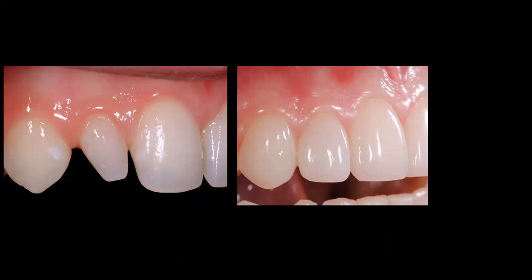So if you had an overhang, a crown margin, if you packed cord, if you cut the tooth, it's not going to look like this. But we see this soft tissue response with Bioclear, and that's why so many periodontists are very excited. And yes, we would love to see some studies done with clinical outcomes with careful Bioclear treatment for black triangles and peg laterals. Go ahead, Disha.